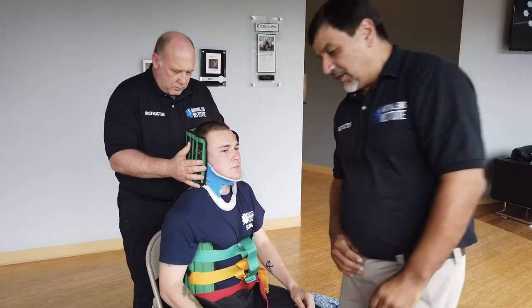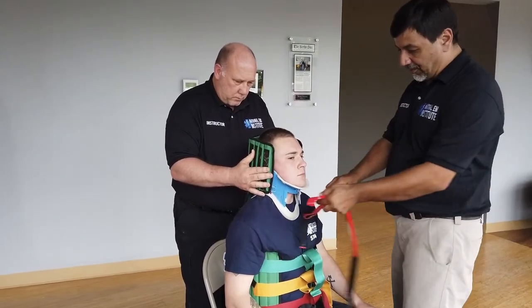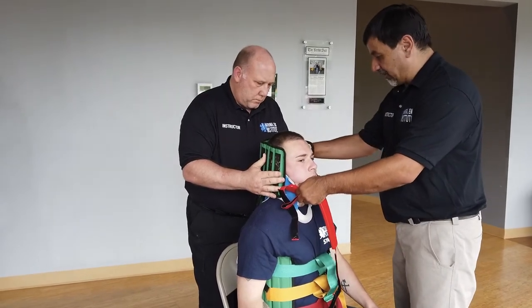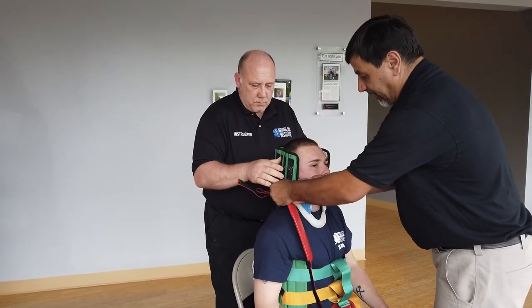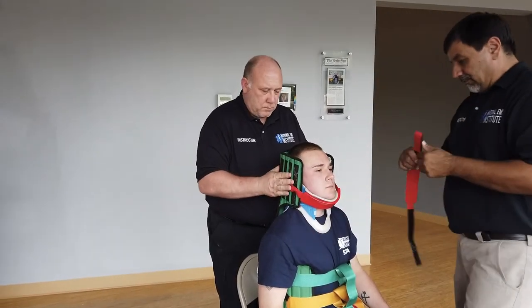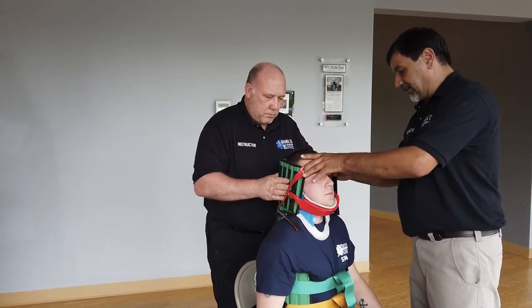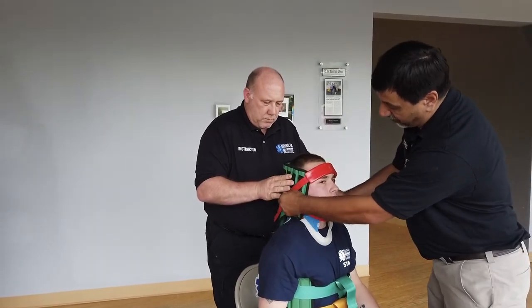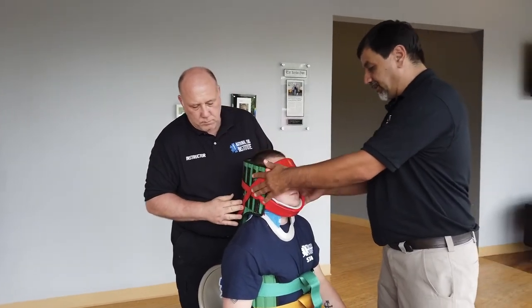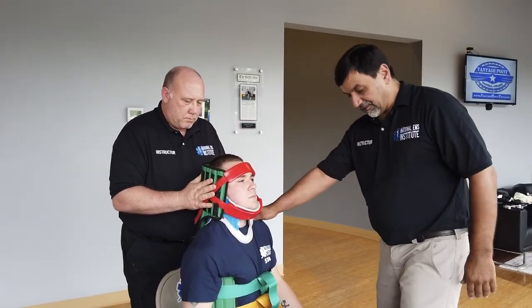At this time we want to secure his head using our straps for the head. Starting with the bottom strap, coming over the collar, having my partner feather in, coming out to the other side feathering in with his hands, putting the strap in place. Now we're also going to do the top strap, holding it on the forehead, bringing it down and feathering it in on each side. As you can see, we have formed around the neck and it's holding into the proper fit around the head. If there were any voids, we would pad them before we went any further.